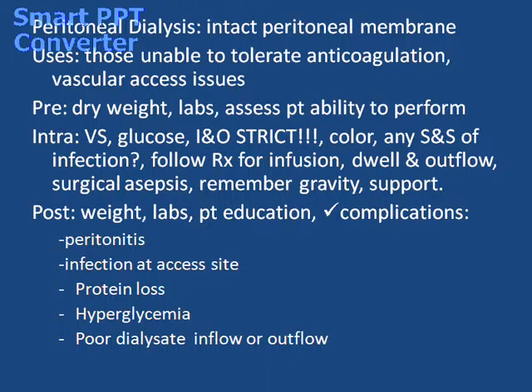So we'll teach the patients how to check for kinks, how to milk the fibrin clot out if they need to, how to monitor the inflow and outflow, change positions, raise the dialysate bag if they need to improve flow, to prevent constipation, and to encourage them to use stool softeners if they are constipated.